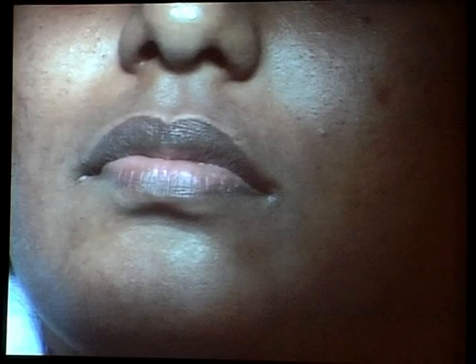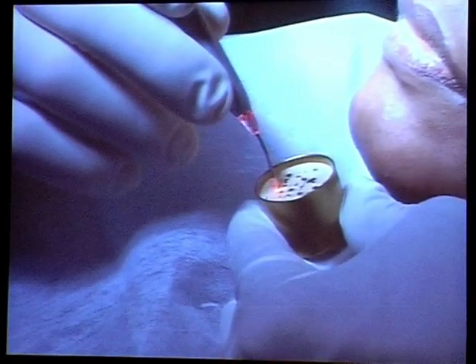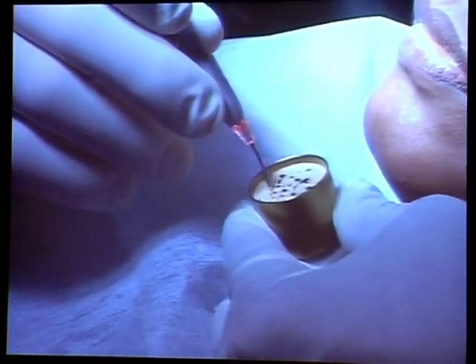Before you start, you have to initiate the fiber, and we do this. Perhaps you can show it. Okay, we do it. Okay, so just fire. Just 1 second, Ralf. He's test firing. Ralf, can you just wait for a second? We're getting a question here.